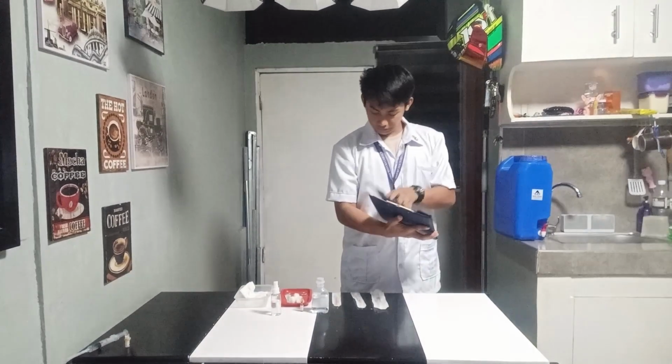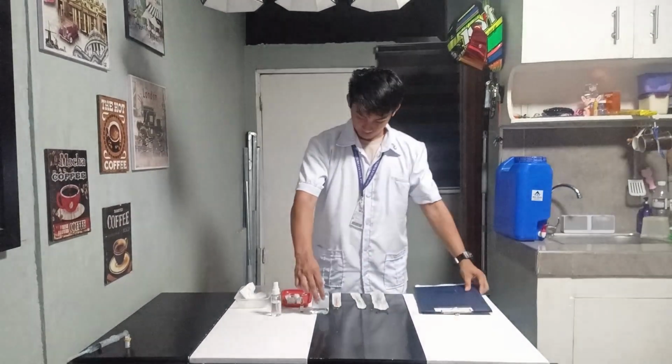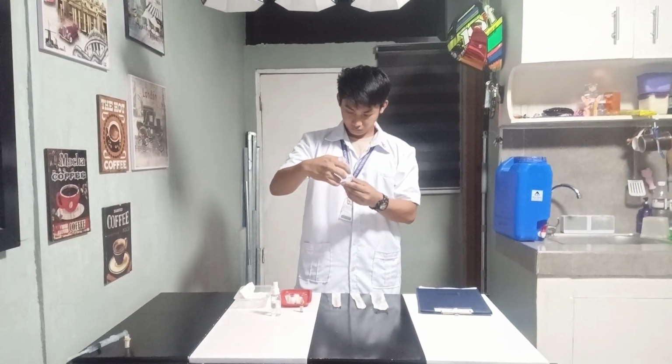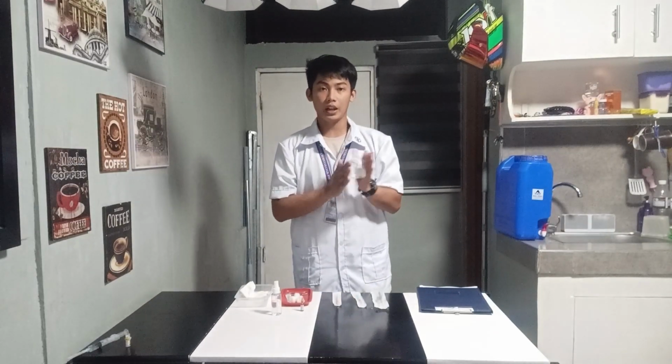So the first thing we're going to do is to confirm the medication, the ceftriaxone. Next, mix the solution if necessary by rotating the vial with the palms of the hands, not by shaking, in order to mix the aqueous solution that tends to settle.